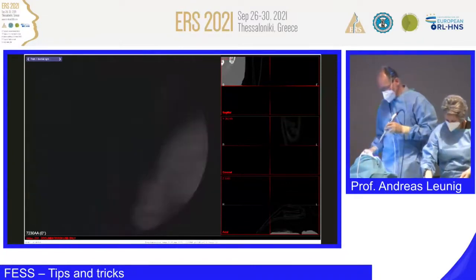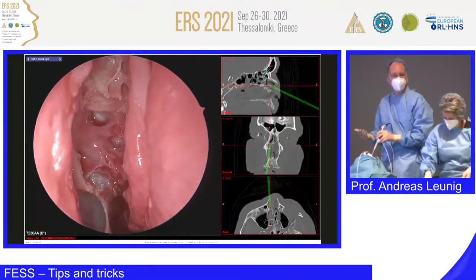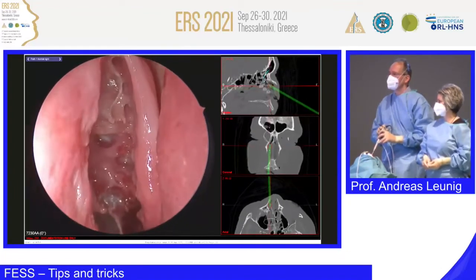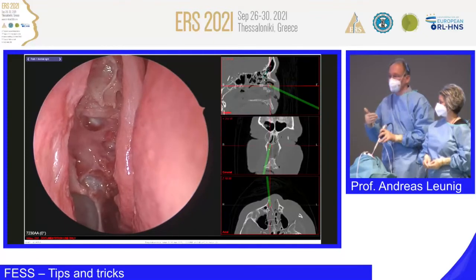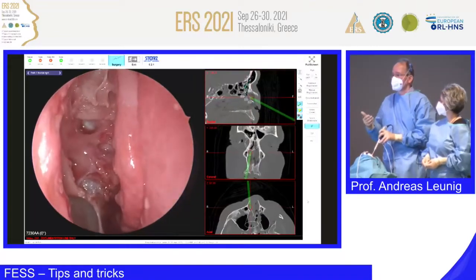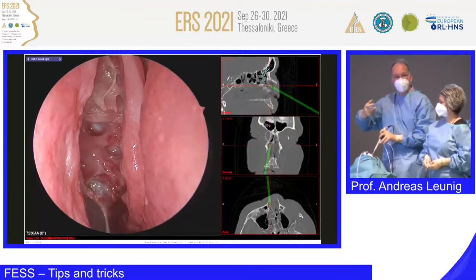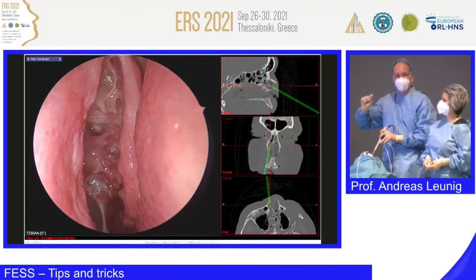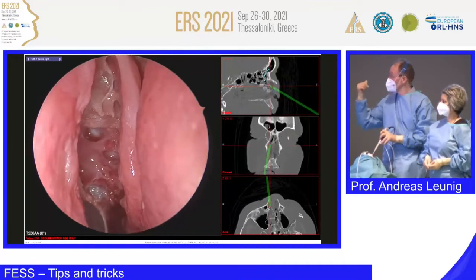No, it depends. Maybe you touched a little artery, but you can usually see it. If it's diffuse bleeding, you talk to the anesthetist. Maybe the patient has higher blood pressure, and he can support your work. Or what I do is use cotton swabs with adrenaline 1 to 5,000, place them in, or you can use a 2 or 3% H2O2 solution just to control the mucosal oozing. And what I use a lot is irrigation. I try to irrigate a lot so the blood is washed away. The surgical field is much brighter, because red absorbs a lot of light and gives a darker picture. So I like to have a nice picture, and I hope you can see it nicely here.